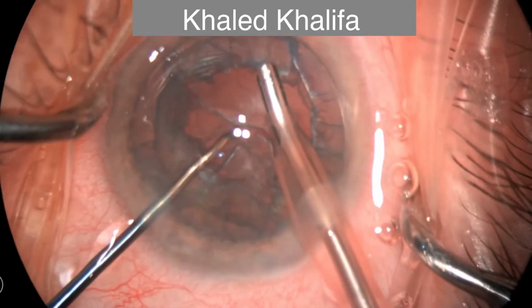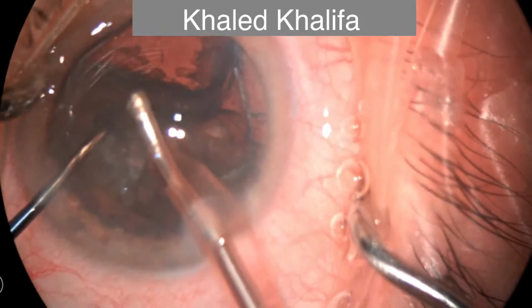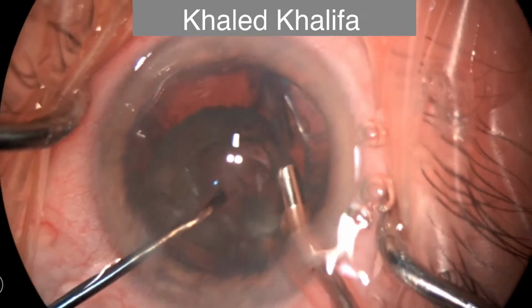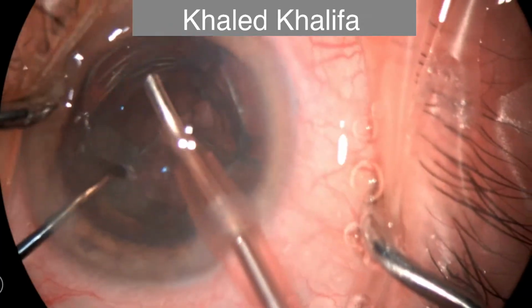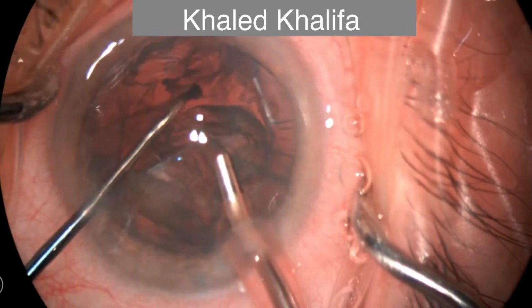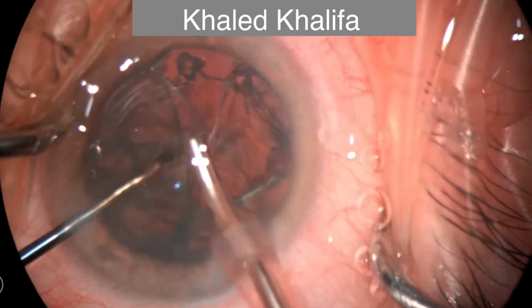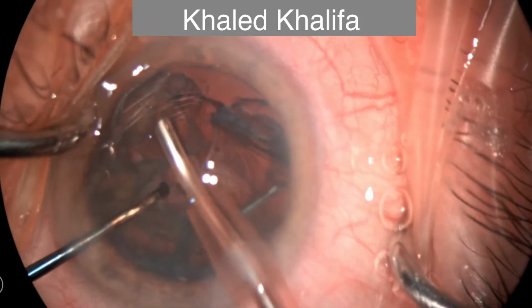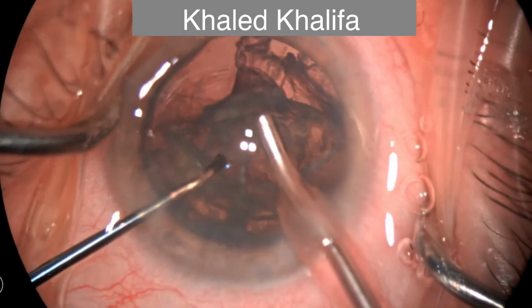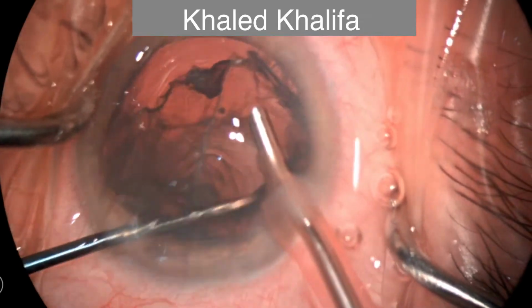Here in this case, the bottle is 60 centimeter and I don't like to have the bottle elevated more than that in all of my cases for the fear of aqueous misdirection and for overstretching the capsule, and it will make the capsule liable for rupture with any touch if it is very stretched. So it's better to keep the lower bottle height and at the same time to try to manage the case in a slow motion phacoemulsification and guarding the posterior capsule with the phaco tip.